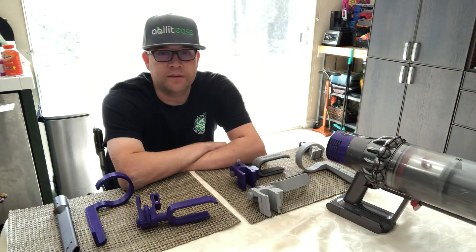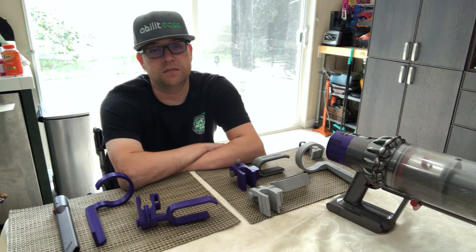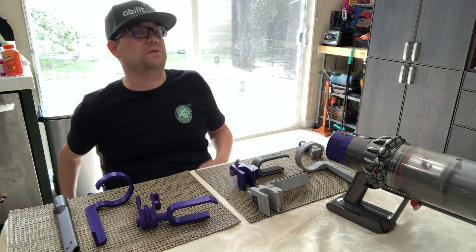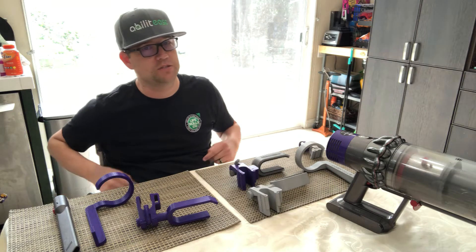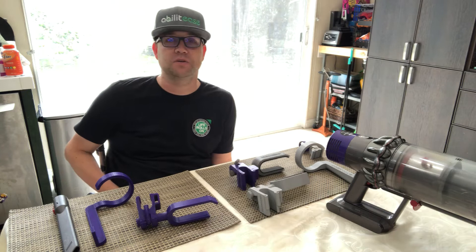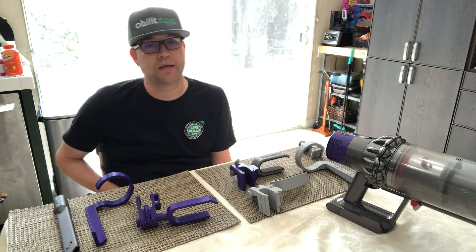Traditionally what I used to use to vacuum my house was an upright vacuum. I would put it between my legs, bend the handle down, flip on the switch, and just push my chair like a snow plow. But that's probably not the safest thing to do, because that piece between my legs could turn and bend and cause damage to my legs and skin.